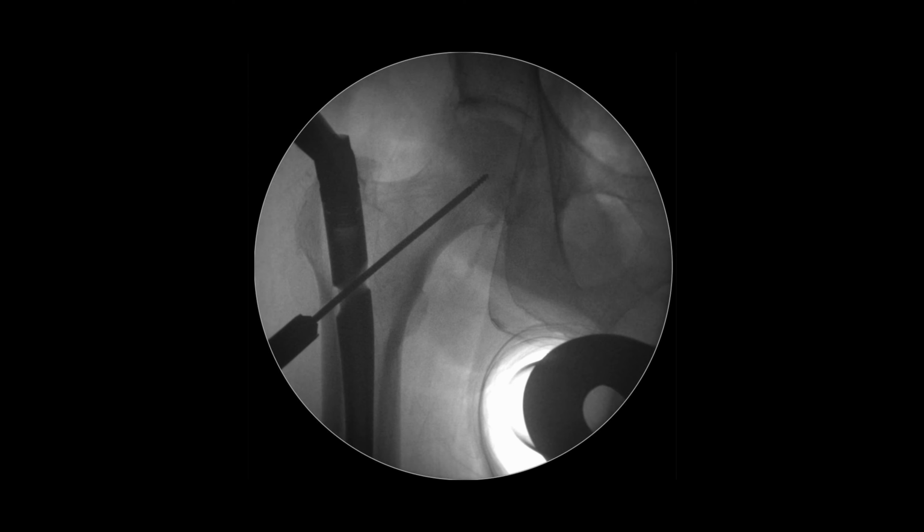The guide wire is inserted subchondraly, so very close to the femoral head joint surface. In this case, you can see the bone is very hard.